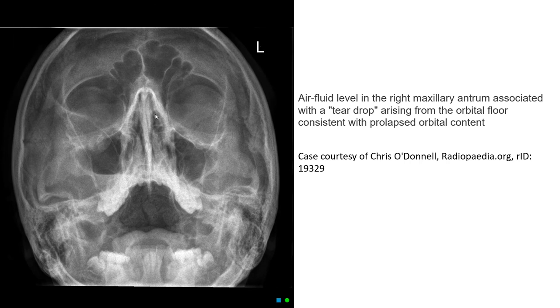Another case of sinus Water's view to show orbital fracture, where we can see the teardrop sign of the right eye with prolapsed orbital contents.